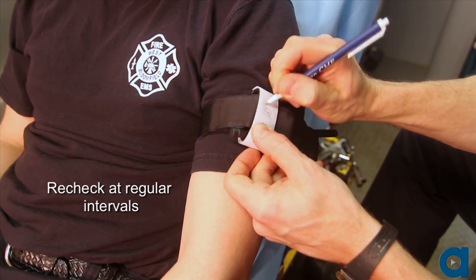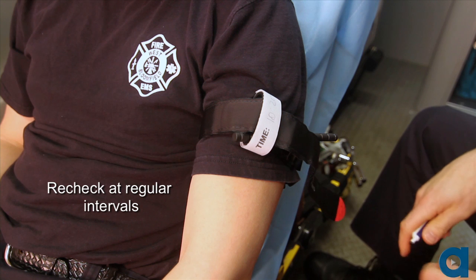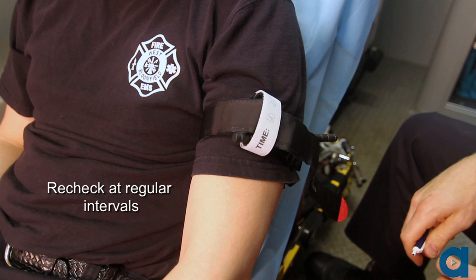Recheck the tourniquet at regular intervals and each time the patient is moved to ensure it remains properly secured and the bleeding remains under control.